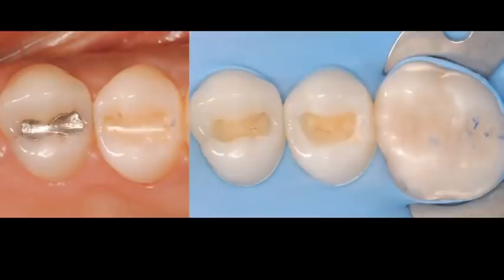So what we're trying to achieve today is to restore posterior teeth to a lifelike appearance. So we're going to make them look as real as we can, as natural as we can. That is our goal today. And I'm going to share with you some tips and tricks on how we go about working on that.